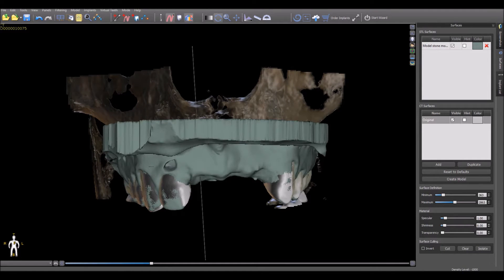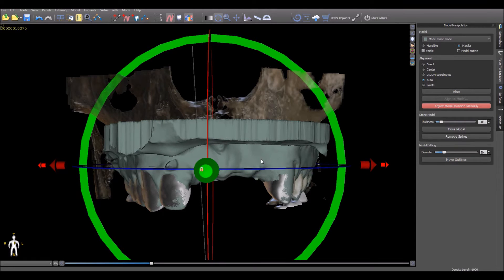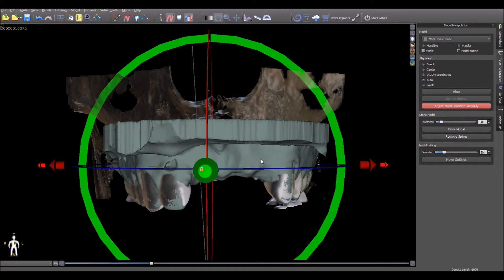To rotate or manipulate a model, simply click on the model position adjustments button to the right top of the 3D view. Now click on the model you would like to rotate. The arrow keys on the keyboard can now be used to move the model in any direction. Once again, to rotate, simply hold down the Alt key and use the arrows on the keyboard to rotate the model accordingly. To stop the manipulation of the model, simply click the same model manipulation button again.